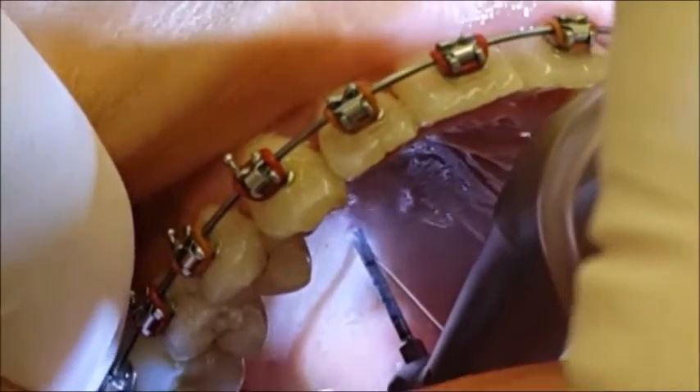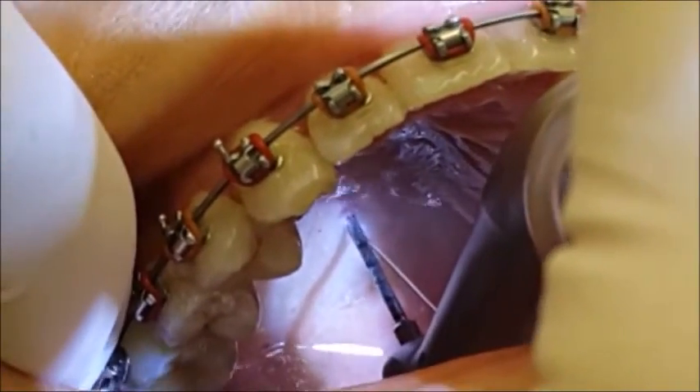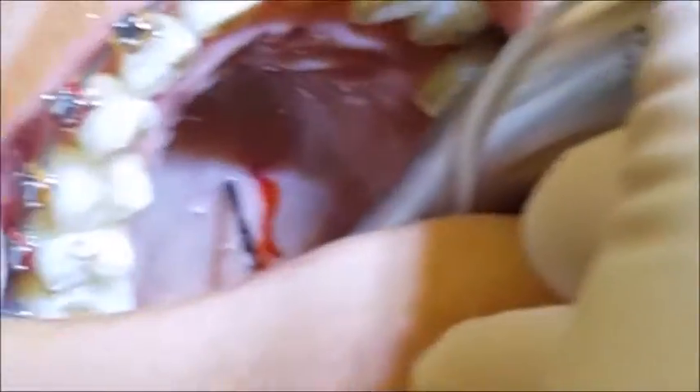There's actually a guide on the pilot drill to tell you the depth, but you just don't want to reach it - just one or two millimeters into the bone and that's it. That's one there; do one more. Almost finished.